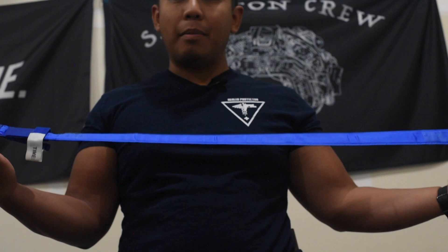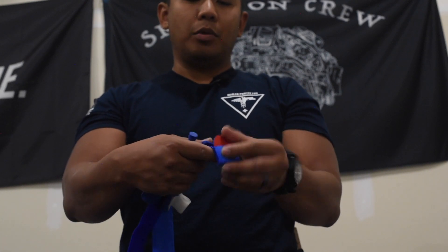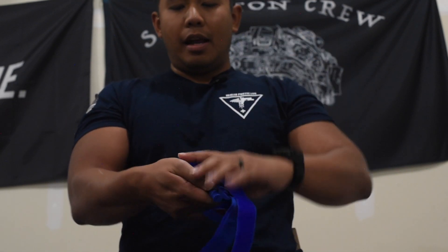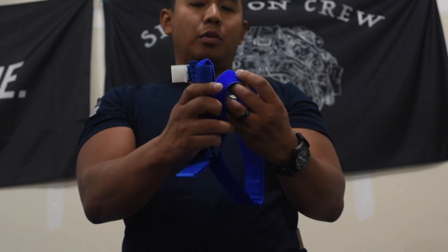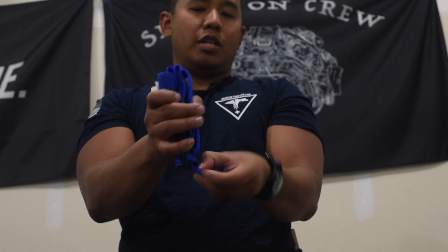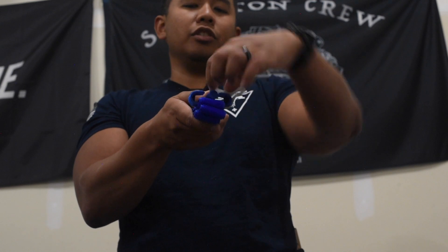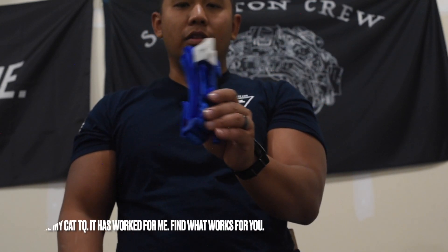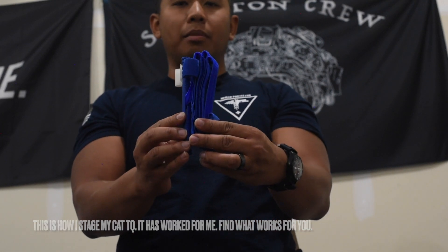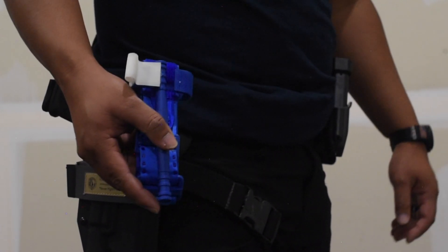I've pulled everything out and the rod is loose. Inspecting the tourniquet — just a good habit to have. I loop the red tip through and fold it in itself so I have something big to grab onto to pull through. Next, I bring this here, fold it in, fold it in again, and it should look like this. The tail goes here. For the time tab, I like to stage it with a little ledge so I can easily pull it. That is how I stage my CAT tourniquet for rapid deployment.